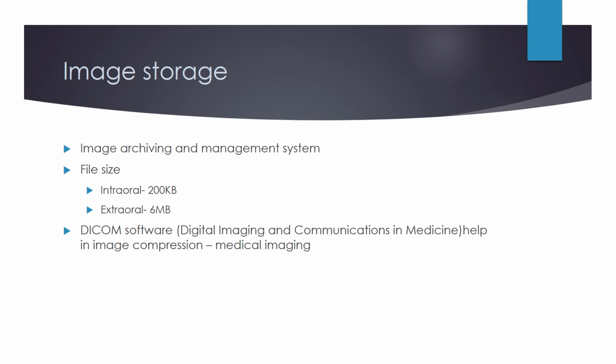Storage, we discussed this earlier, but let me tell you again. Storing digital images is an excellent method of archiving, and management systems exist. The software itself can act as an archive for you, where you can store multiple images. The image size of an intraoral image can be about 200 kb, and an extraoral is much bigger than that.